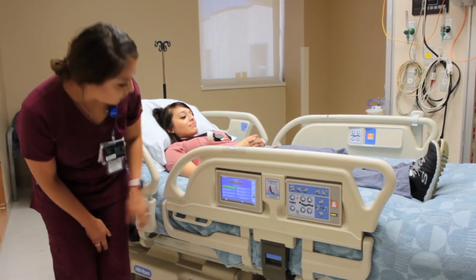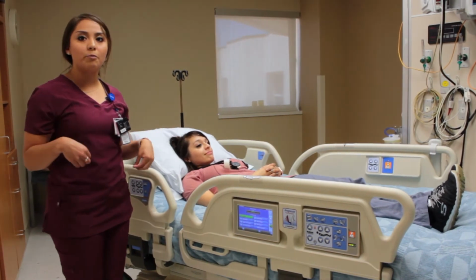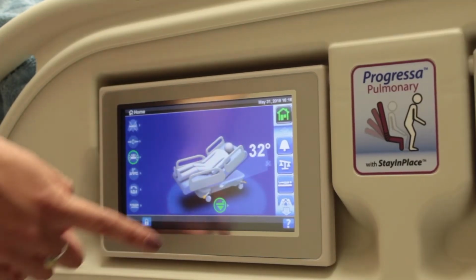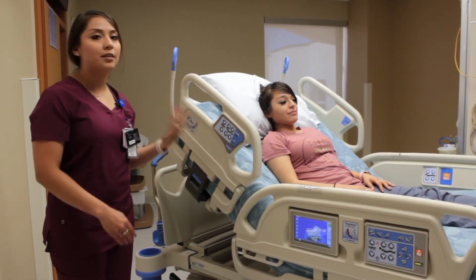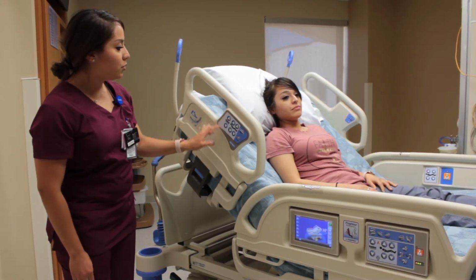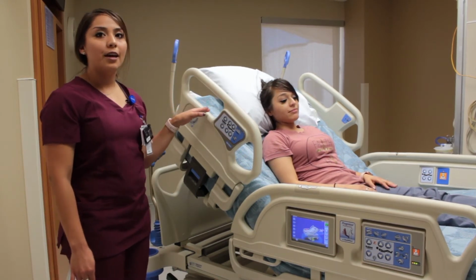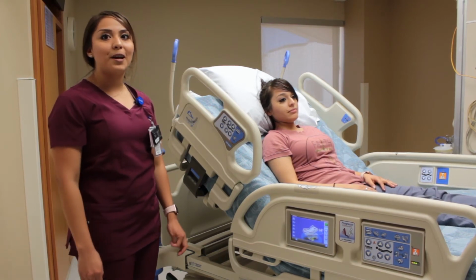We have a turn assist feature, and we're all super excited to use it because it's going to be a lot easier on our backs, as well as easier for the patients, more comfortable for us to turn them. We sometimes do get confused patients or restless patients that like to move their own bed, and if they do move it below a certain degree, it does increase their risks of complications. So this bed now allows us to lock the bed into a certain degree, which is displayed on the screen. It helps us lock it into that degree to where the patient is not able to control that. And if they are trying to mess with the settings, it will alert the nurses right away.